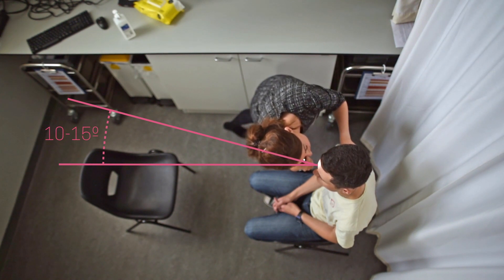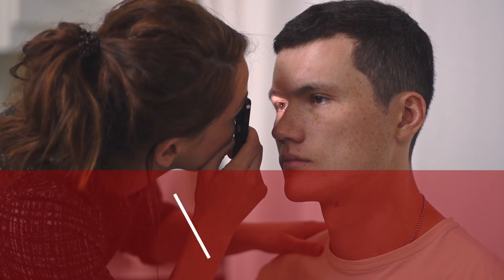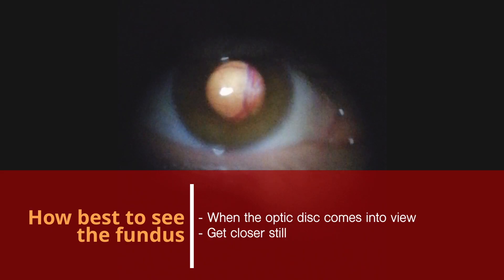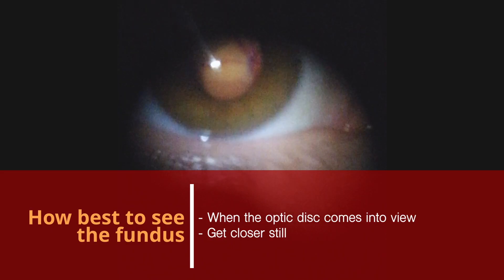When you're close to the eye, the optic disc should come into view. Go in closer still and you'll get a wider and more stable view.